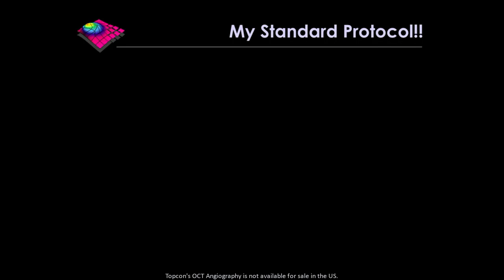Now, what I've done is I have a standard protocol in place for my patients who come, and essentially I get this protocol on every patient with moderate and above diabetic retinopathy: moderate non-proliferative, severe non-proliferative, and all my proliferative diabetic retinopathy cases, every time.